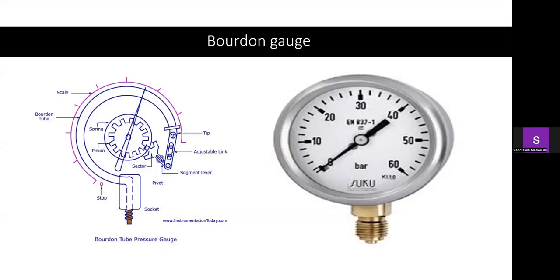It's not reliable, Dr. Sukan, because nitrous oxide is stored as a liquid and also as a gas. So the Bourdon gauge will only detect a change when, okay, the pressure from the vapor will still be the same despite the changes in the liquid.